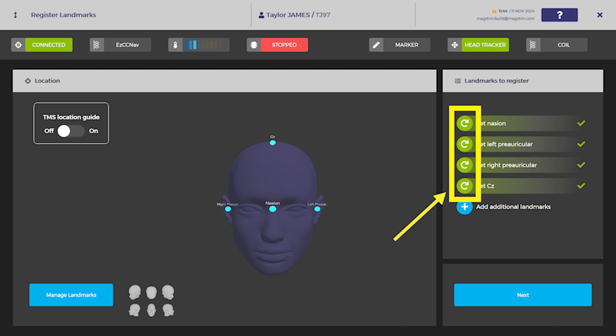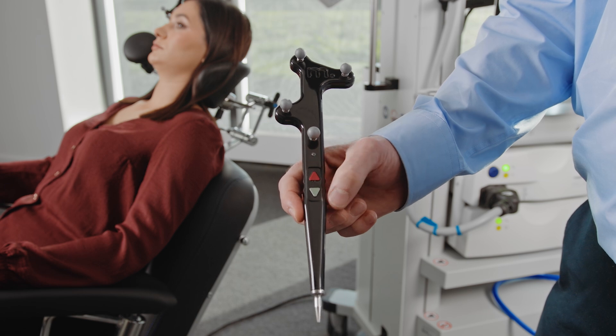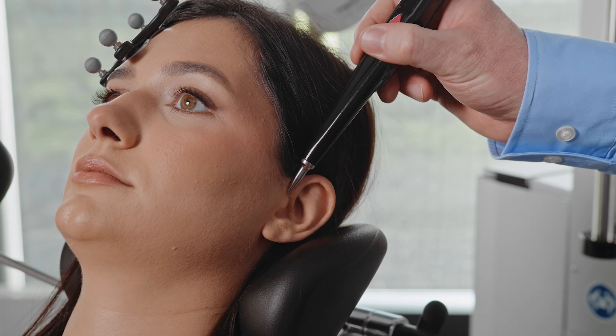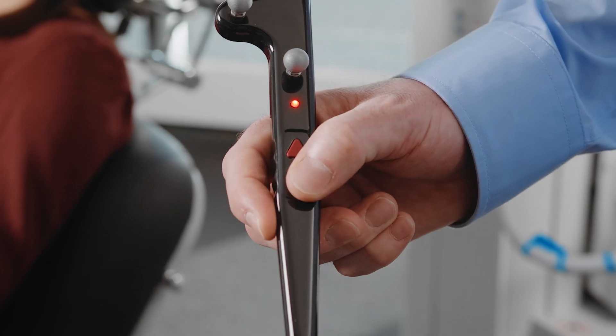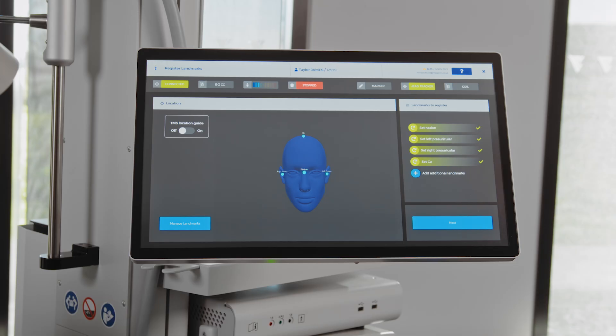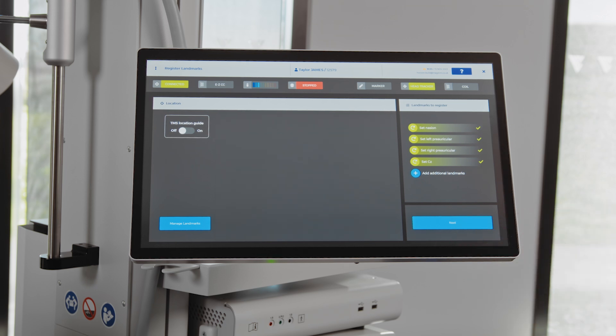To unregister a landmark, select the Redo icon on the screen or press the red button on the remote pointer tool and repeat the landmark site registration. Once all landmarks have been registered, select Next.